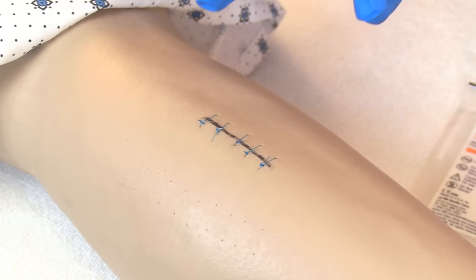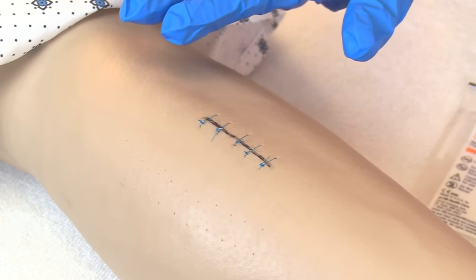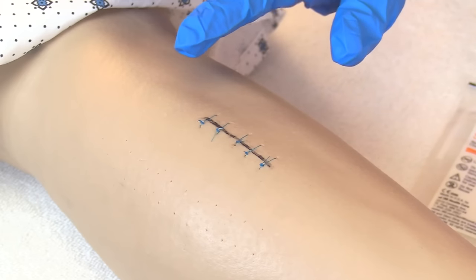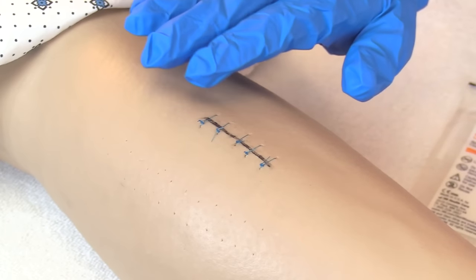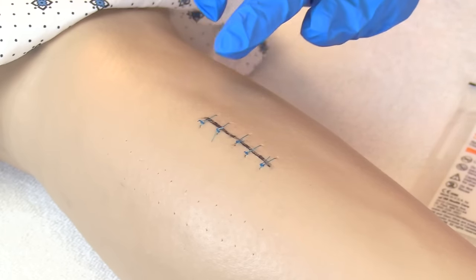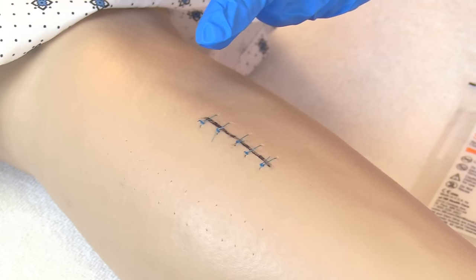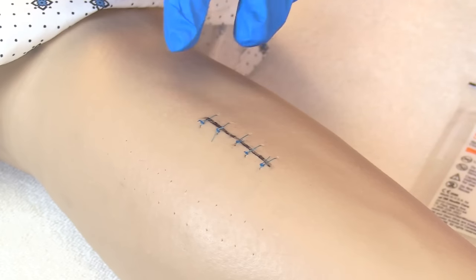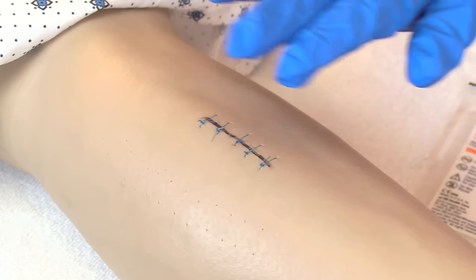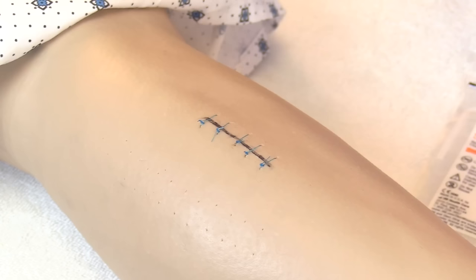Perform hand hygiene and don clean gloves, because first you want to assess the wound before removing sutures. Remove any old dressings and check for signs of infection: Is the site red? Warm to the touch? Are there any hard areas, foul-looking drainage, or a smell? Also look at the suture line itself — does the skin look nicely fused together, or does it look weak? If any of those signs are present, notify the physician before removing the sutures.